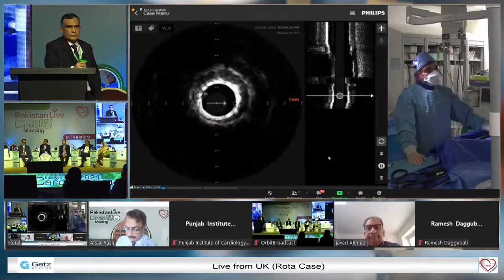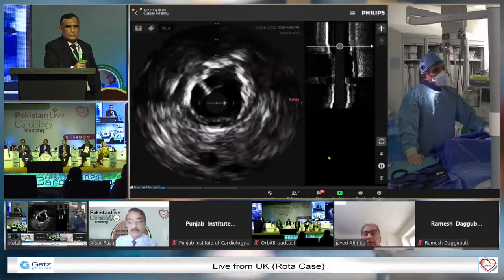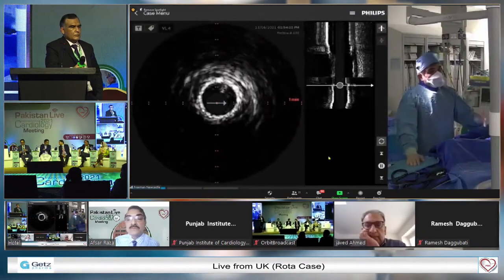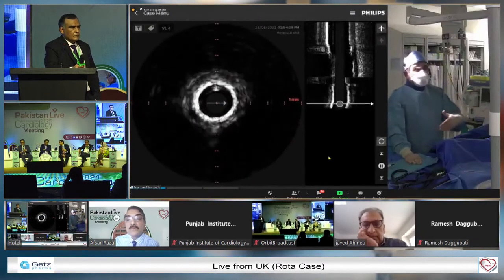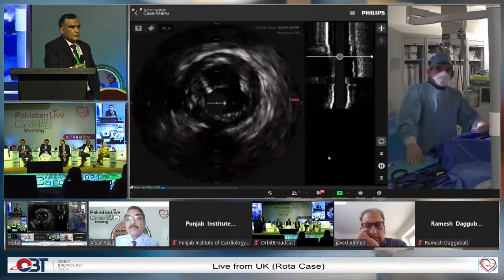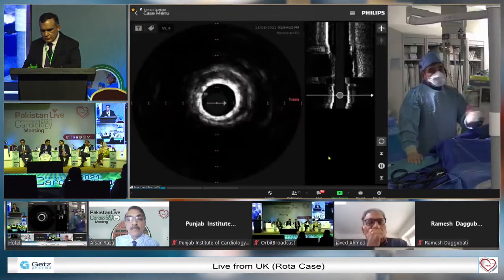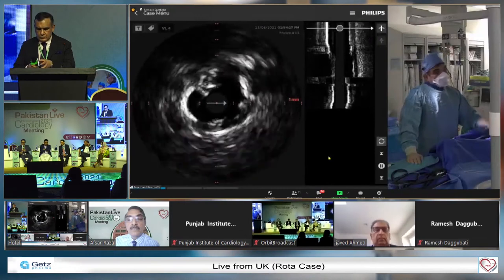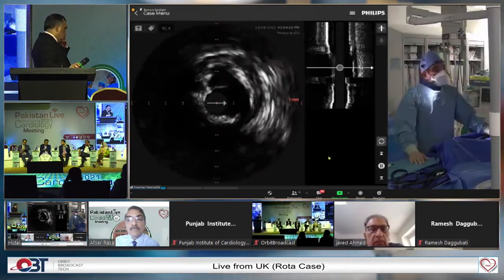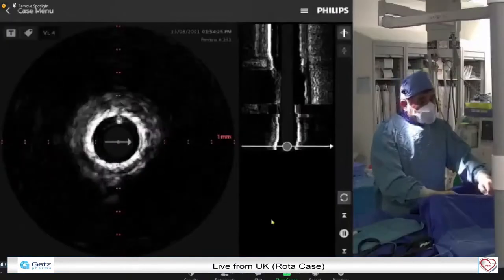Well, Javed, the studies you're talking about are more than 30, 40 years old. Even now, to my mind, I need to prepare the lesion. It's not only about delivering the stent, it's about making sure that it's the best outcome when you deploy the stent. Because if it is under-expanded or under-deployed, there's always a recipe for a problem later on. So I think preparing the lesion well is the most important part. So this is what we did anyway, and let's go forward.